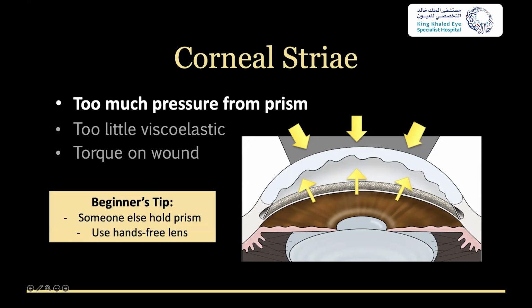So for those first cases that I have my residents do, I'll often have someone hold the prism for them. That way their whole focus is on their surgical hand. There are also hands-free lenses that are available for this.